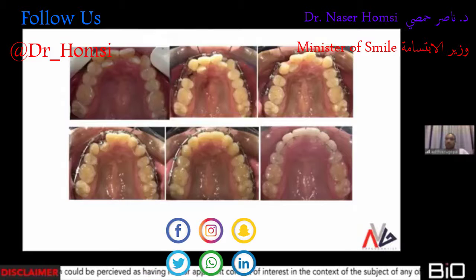So as you can see, it's a hard task. And the mistake I made was going appliance driven. I thought that I'm going to be using this particular bracket, and this is going to give me the desired results. So that is the mistake over here. I should have diagnosed this case differently and then decided which appliance was to be used in this particular case. So now, given a chance, I would never treat these cases in such a way.